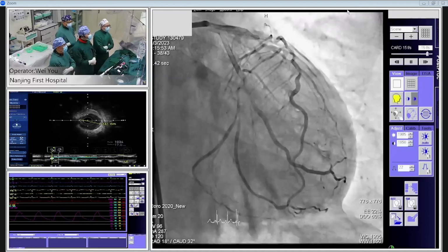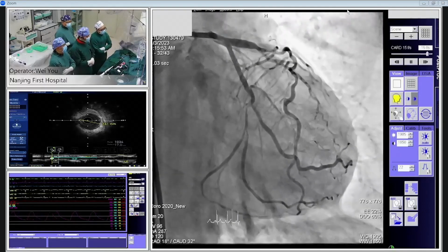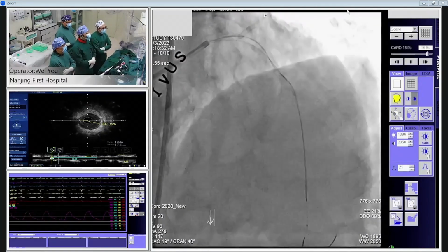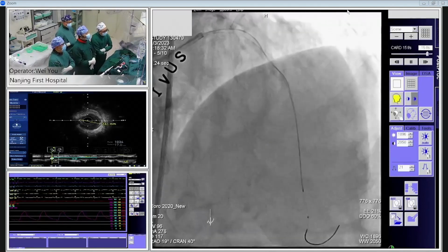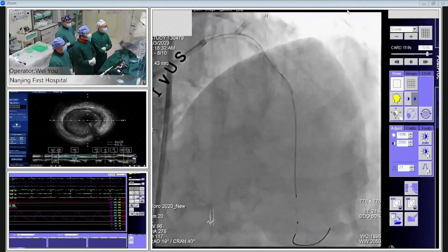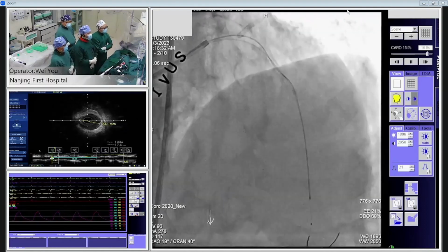So before that, we just talked with our team and guided by our chief, Professor Zhang, and we just made our schedule today. Because our target lesion is LAD, severe calcified lesion, we perform the IVUS. As we all know, the data from the subgroup analysis of the ULTIMATE study told us, for the severe calcified lesion group, the IVUS-guided PCI has the privilege when compared with the angio-guided PCI. So IVUS casts very smoothly, just we send to the distal segment of LAD.